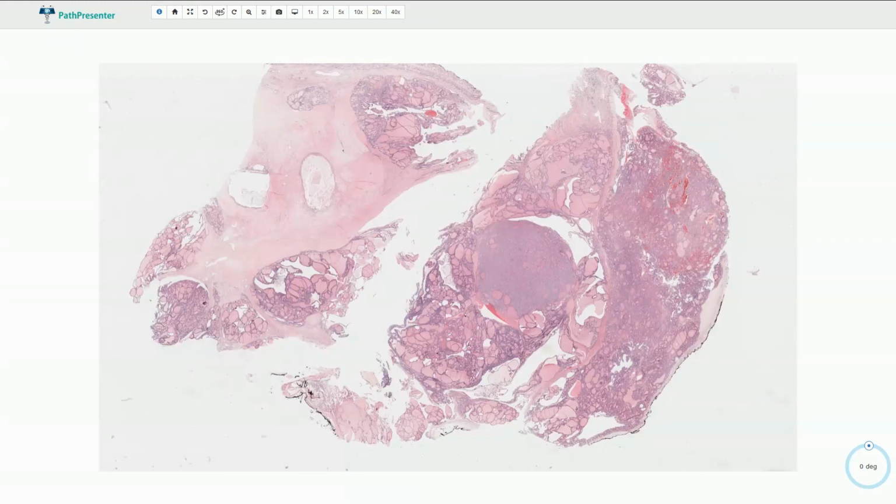Multinodular goiter, which is also called multinodular hyperplasia or adenomatous hyperplasia of the thyroid gland, is multinodular transformation of the thyroid gland parenchyma, which is usually asymmetric, and it is associated with enlargement of the thyroid gland. The etiology is multifactorial. The process is associated with follicular epithelial hyperplasia, which could be caused by impaired thyroid hormone production, or it could be associated with increased thyroid stimulating hormone secretion.